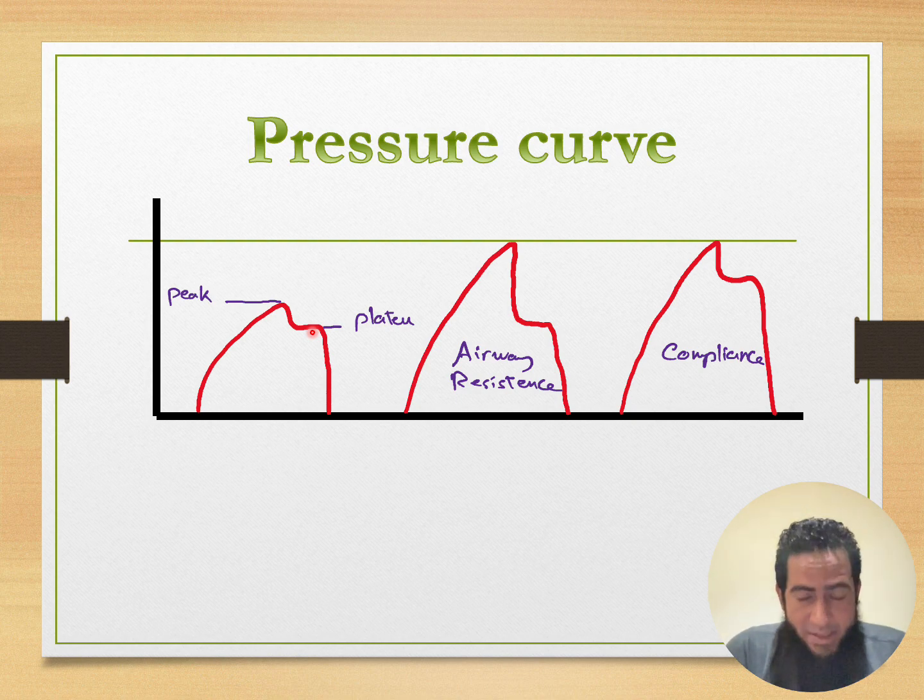got many benefits, I mean, for the patient. The first thing is that it increases the mean airway pressure.